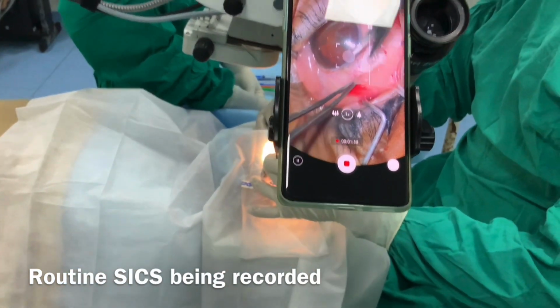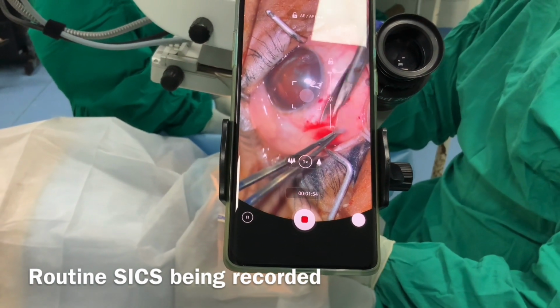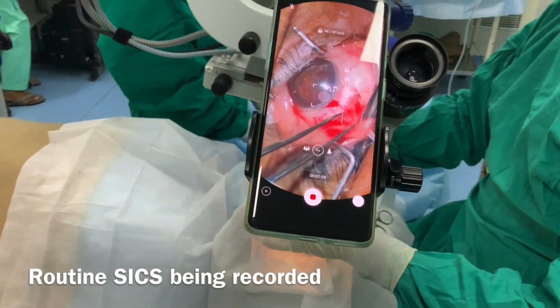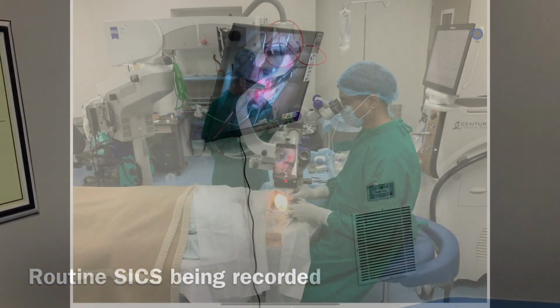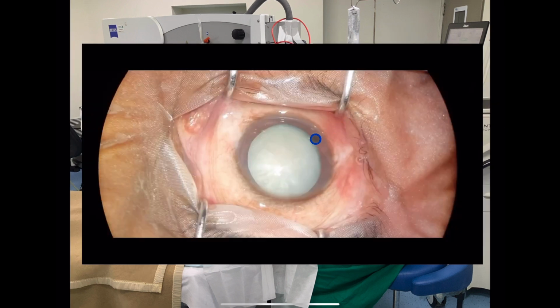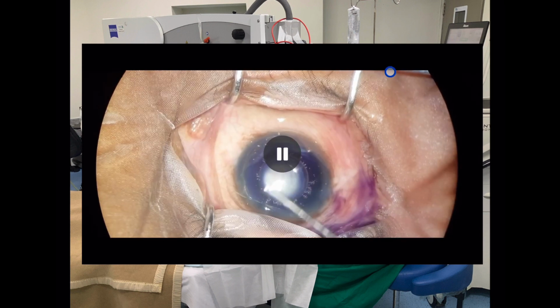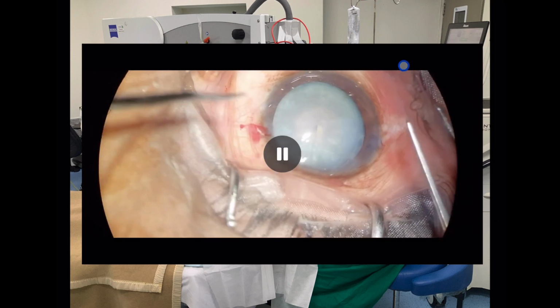Here is the routine SICS being recorded. This is how the whole system looks like. This is the quality check video. You can yourself see the video quality that is taken through the smartphone.